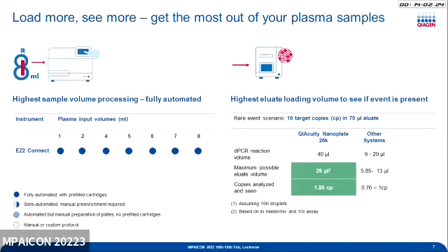In that case your copies are low, and you are limiting the amount of eluate. But here you can increase the eluate because we can go up to 40 microliter reaction. So it increases your efficiency as well as the sensitivity of the platform, I would say.